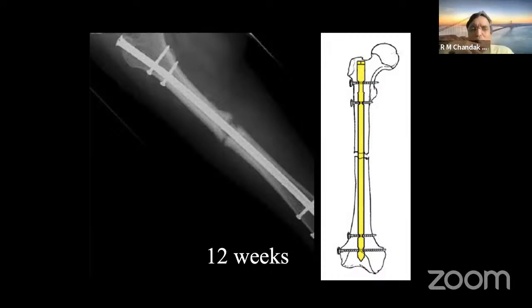I would not suggest him dynamization. If at all I want to revise this, I would go ahead with an augmentation plate and addition of grafts in the defect. That would be my final solution to him. That is right. But one surgeon has advised him dynamization. I would not advise him dynamization. Okay. Now we have discussed it. It is a very confusing situation as far as dynamization is concerned, so we must keep our concepts clear-cut with the evidence.